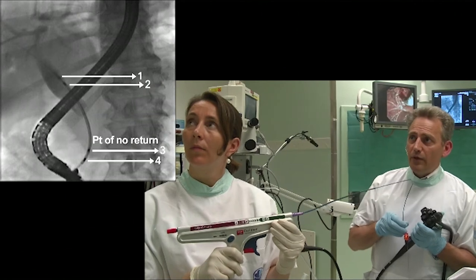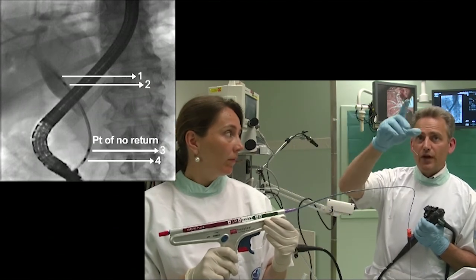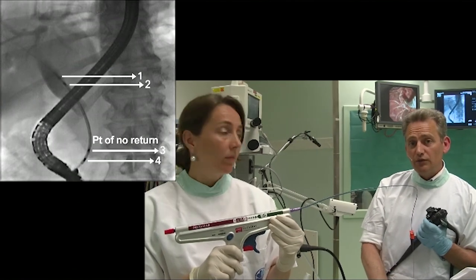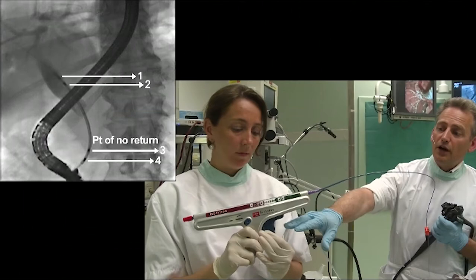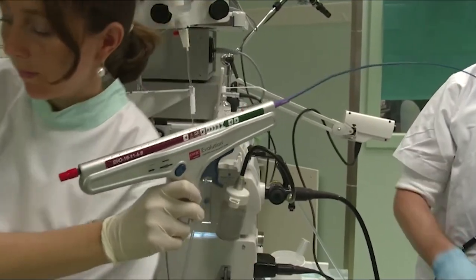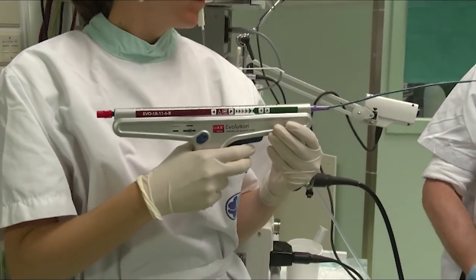So I'm now happy with the position of the stent. I'm happy now with the position endoscopically. I'm also happy with the position fluoroscopically. And what we do now is we will start deploying the stent, which will be done in a very controlled way with slow movements by pushing the handle. The nurse will do this. She now removes the protection feature in order not to deploy the stent prematurely.